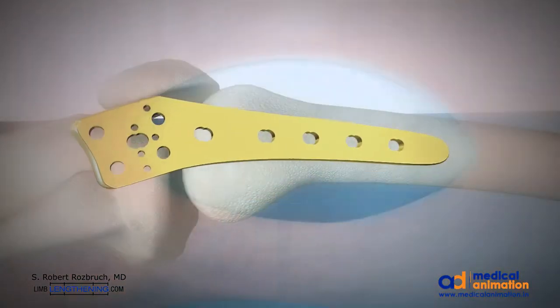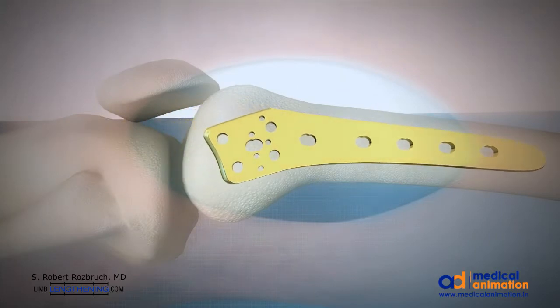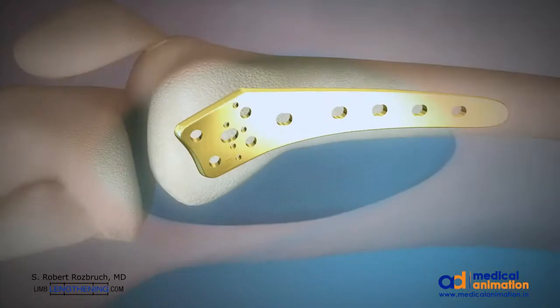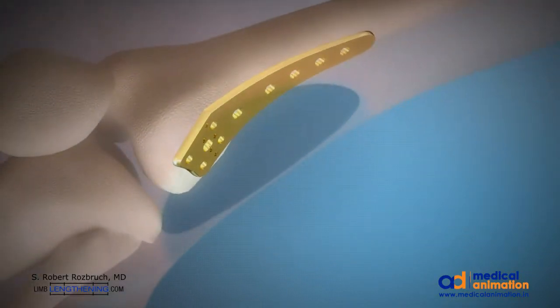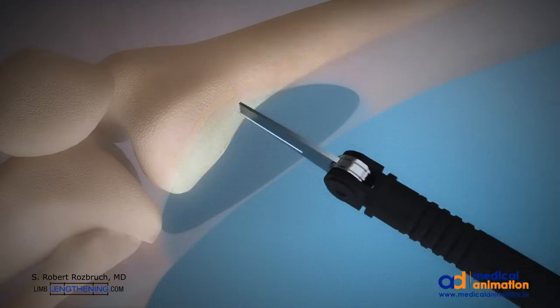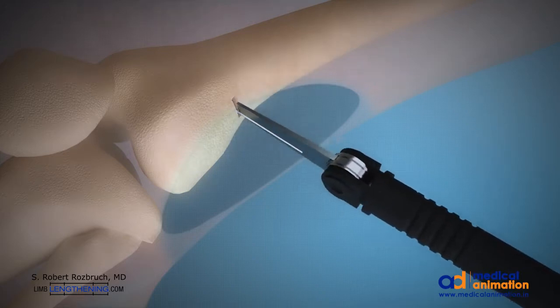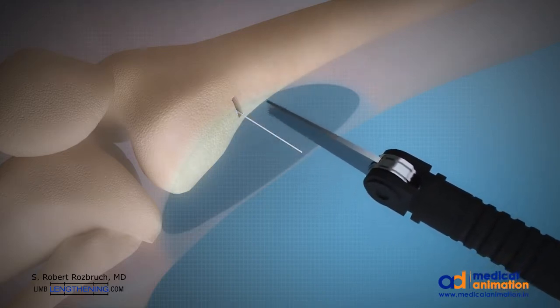I use a titanium plate as stabilization and also as a template for choosing my osteotomy location. The position and orientation of the osteotomy is planned with a wire and then executed with a microsagittal saw, done while cooled with saline to avoid thermal necrosis.